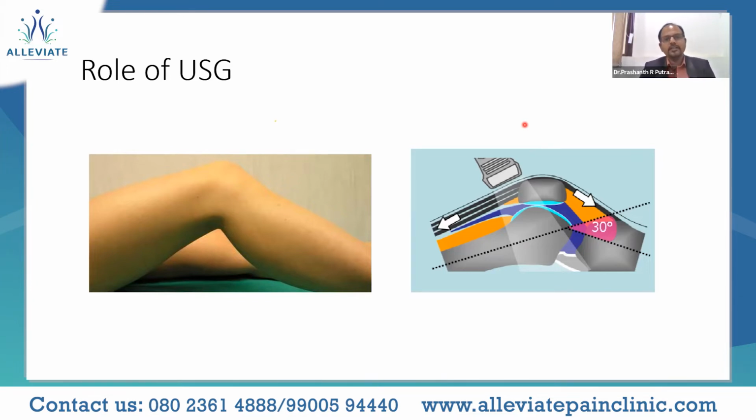Okay. So here we have two pictures wherein the knee is placed in flexion of 20 to 30 degrees. This is important because the extensor mechanism, that is the quadriceps tendon, the patella, they usually attain a concave scenario if the knee is completely extended.